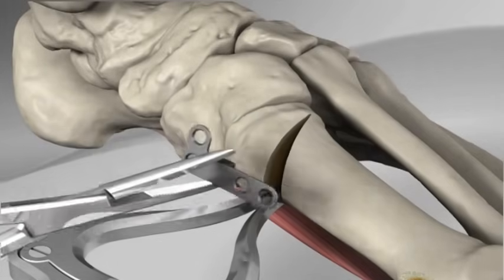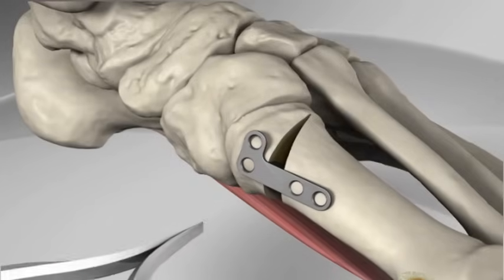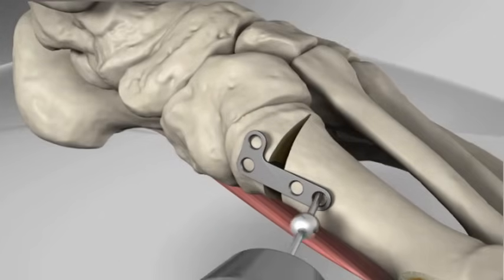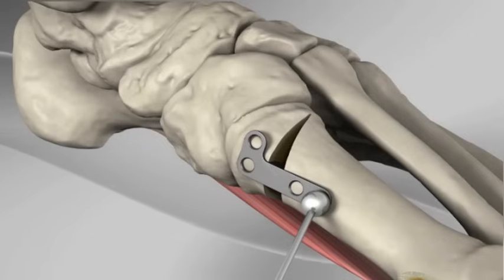When the toe appears straight, the plate is placed on the side of the bone and the jack is removed. The plate is temporarily held to the bone by a pin. The pin contains a ball or olive on it to help hold the plate in place.